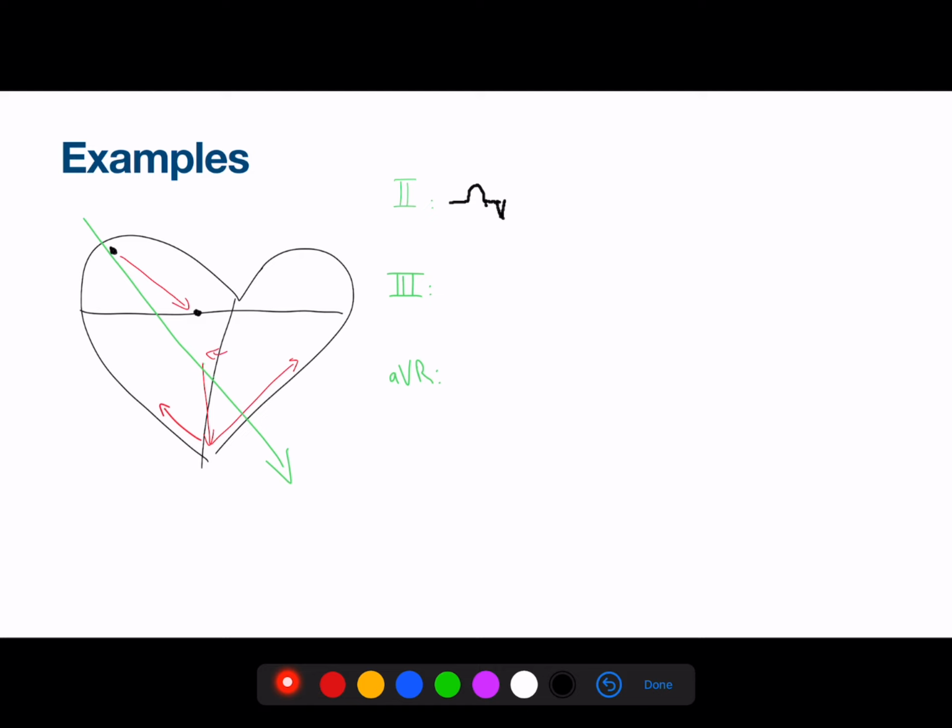Then, the general vector goes up towards the positive electrode, and some vectors also go in the opposite direction, so we have the basic QRS complex. The repolarization of the ventricle, like I said, goes in the opposite direction, but it's negative, so negative and negative goes to positive.